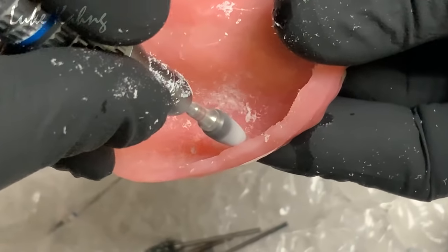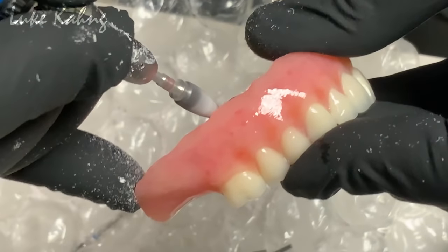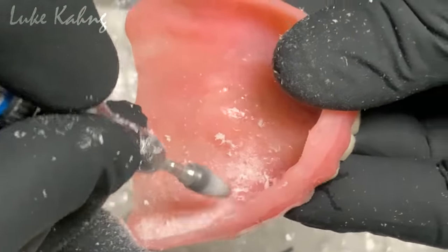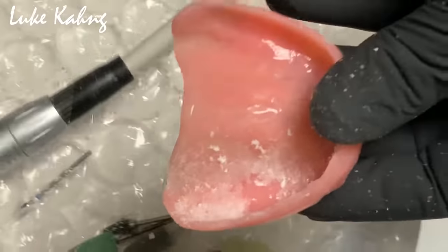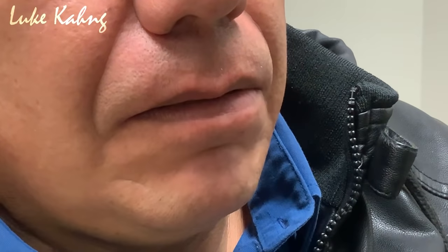So, again, I use the red carbide, right? Just a little bit. Maybe you're feeling just a little tiny bit right here. Just in here, just smoothing it out right here. Right there. So we got the entire thing now. See that? Perfection. Absolutely cool. Stunning. See, it goes right in now. Now he feels comfortable. He says it feels a lot more natural. It's not as thick. It goes into the sulcus just perfectly there.